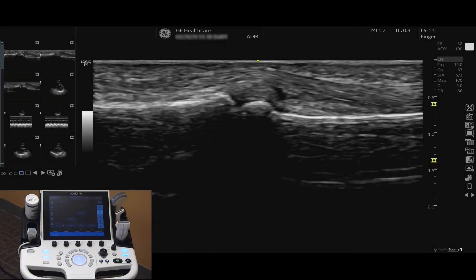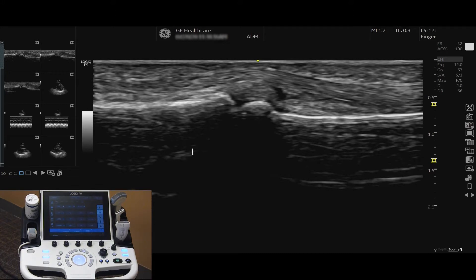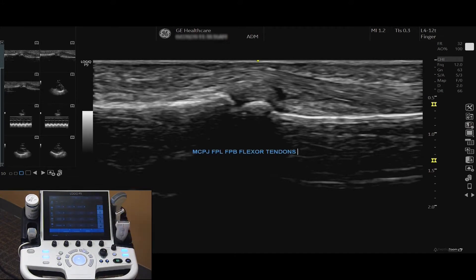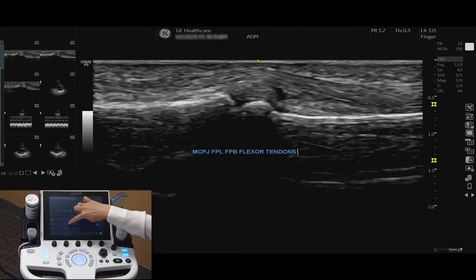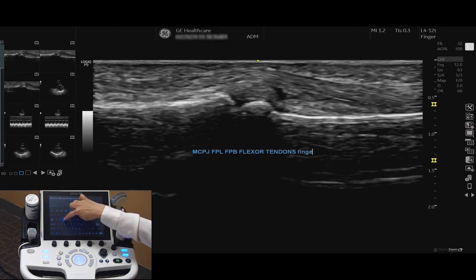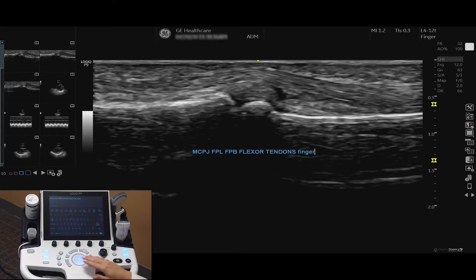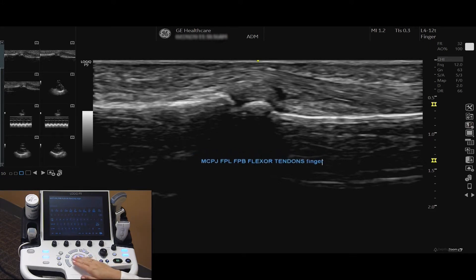To add an annotation, select the comment button on the operator panel. Choose your comments from the annotation library. You can also activate the virtual keyboard from the touch screen to type your comments. Using the trackball, you can move the annotation to its desired location.